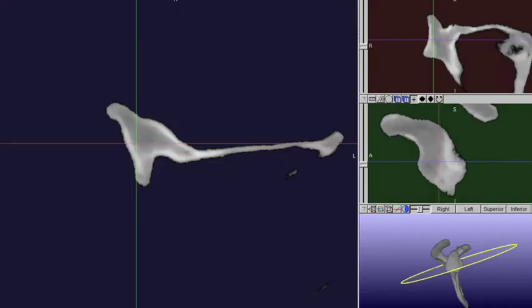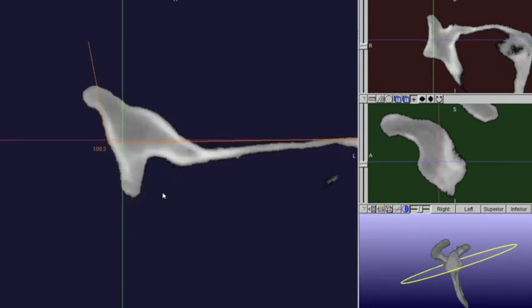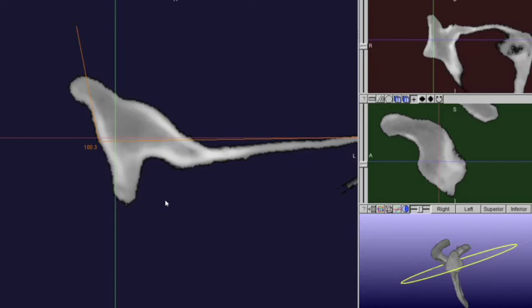We next need to evaluate the patient's pre-morbid glenoid anatomy, which may be a new step for many. This is represented by the anterior half of the glenoid in a patient with B2 morphology. We do this using the angle tool within the software, drawing a line consistent with Friedman's line from the medial border of the scapula to the center of the glenoid and across the anterior half of the glenoid. In this patient, the anterior glenoid is retroverted 10.3 degrees, so our goal will be to place an implant retroverted roughly 10 degrees.